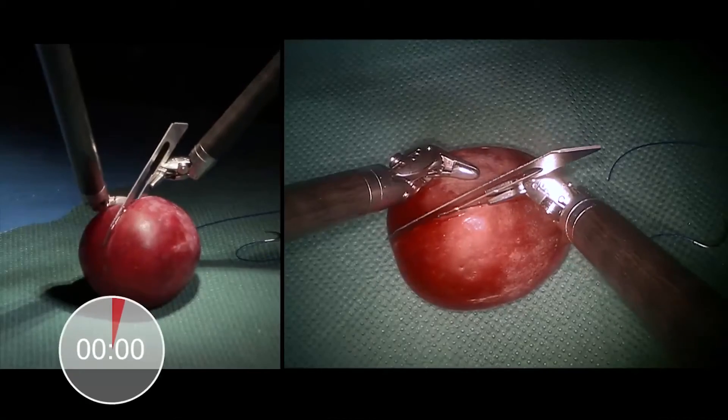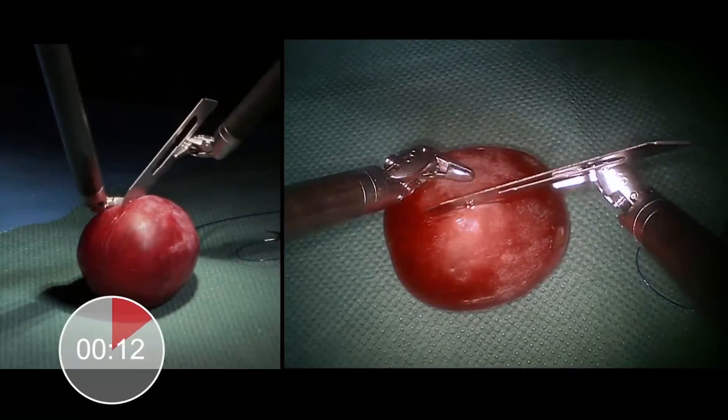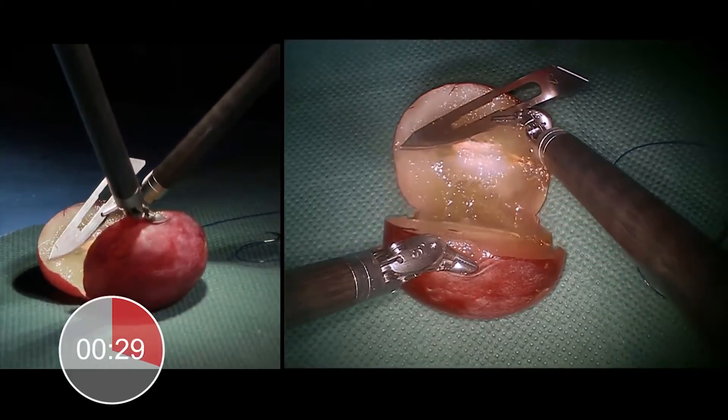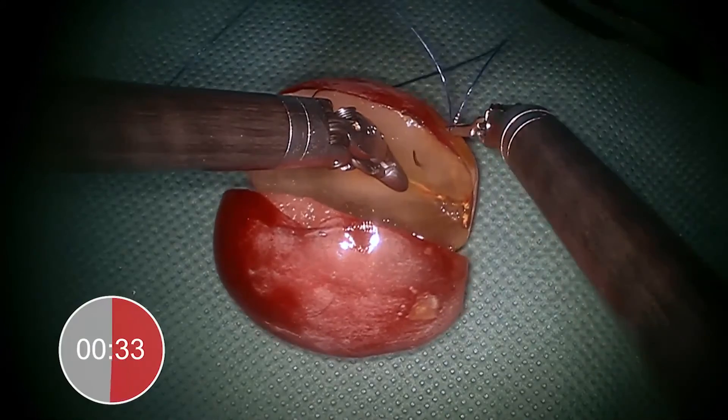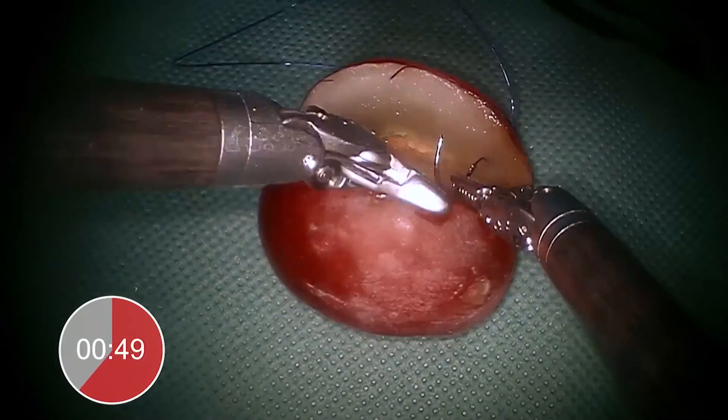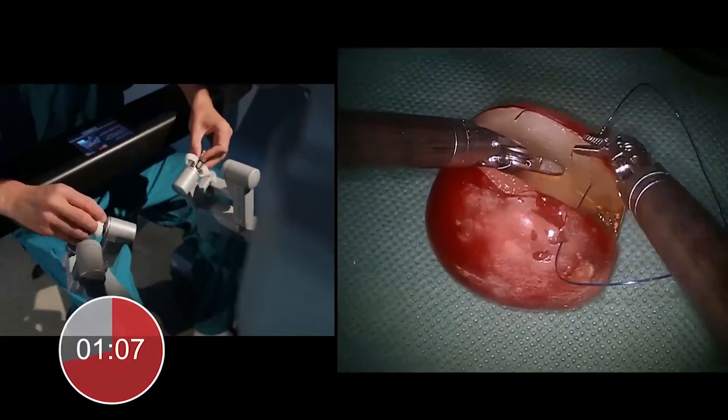And the last task is to cut and then sew together a small grape. It took the system less than ten seconds and only one movement to tie a knot with the thread.